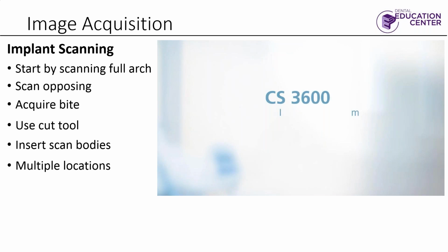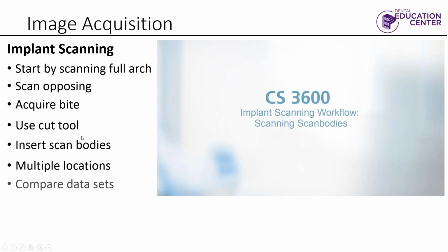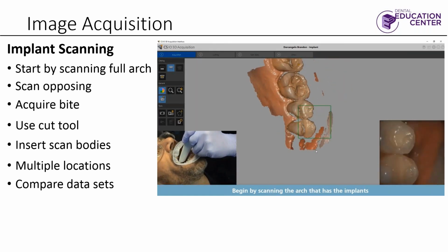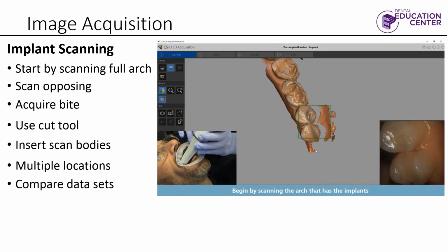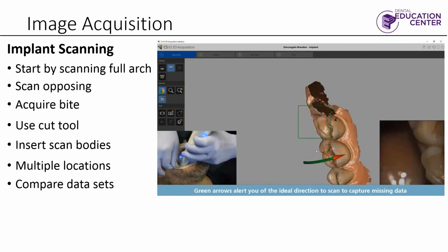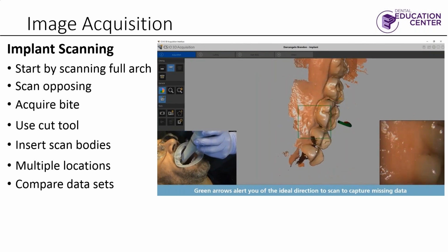This is a video I wanted to share, and this is something that we always talk about. It's implant scanning. How do you do it, and what are the steps? So I thought this is actually a very relevant video to share with you guys. So we'd start by scanning the mouth, obviously, or the full arch that we're going to be doing.